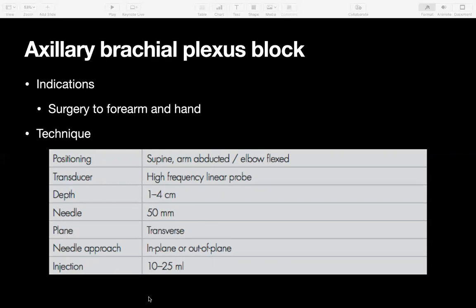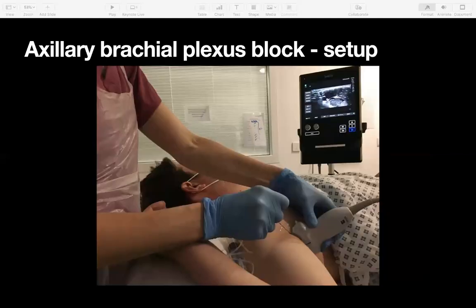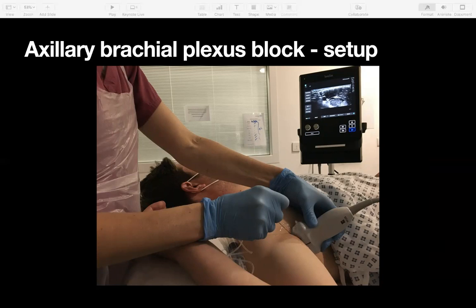The volume of local would depend on whether you're going for analgesia or anaesthesia — generally 20 to 25 mils gives a fairly reliable block. The setup picture shows the patient's hand not quite under their head, arm in a relaxed position, which they can maintain for five to ten minutes during the block while still giving good access to the axilla. Trying to line everything up in a straight line makes it ergonomical, with the ultrasound machine positioned depending on where you want to stand.